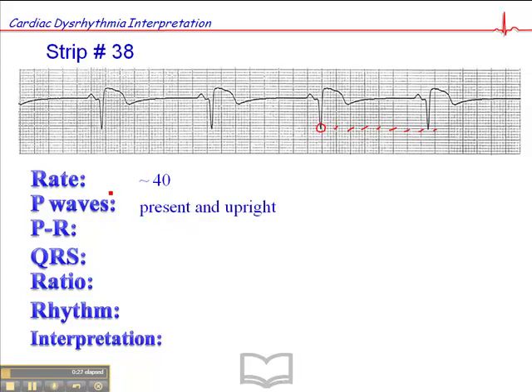P-waves are present and upright and consistent throughout. So the P-wave morphology is consistent there. The PR interval is 0.16 second. The QRS is actually narrow, less than 0.12 second.